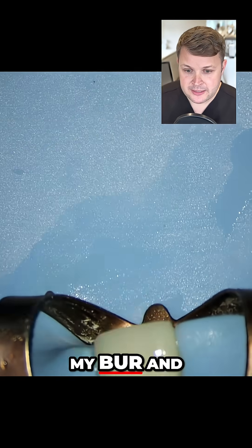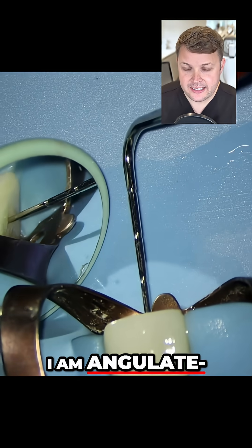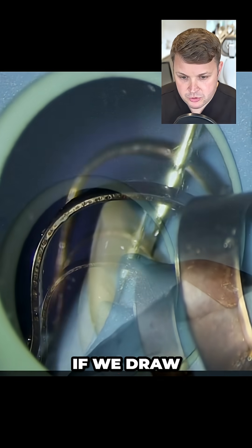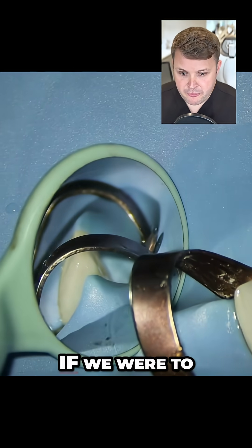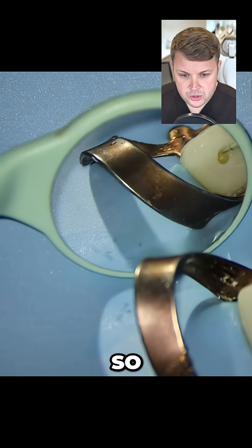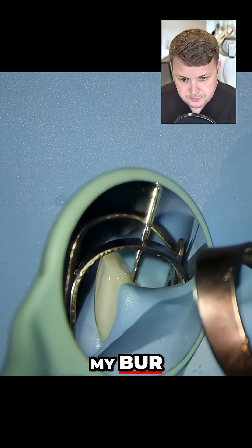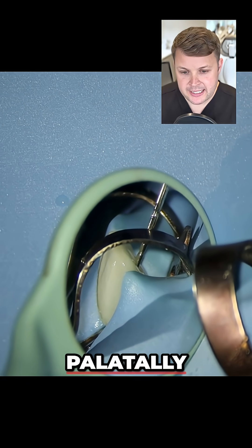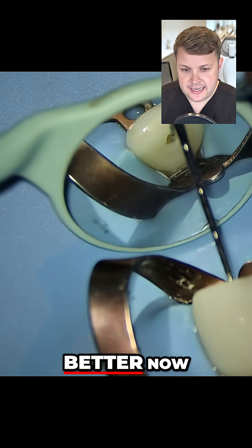I'm going to swap out my burr, and I've noticed that I am angulating my burr in the wrong direction. If we draw an arrow here, we can see that if we were to drill any further, this is going to go out of the tooth buccally. So what I need to do is adjust my angulation a little bit further palatially, and we can see that it looks a little bit better now.